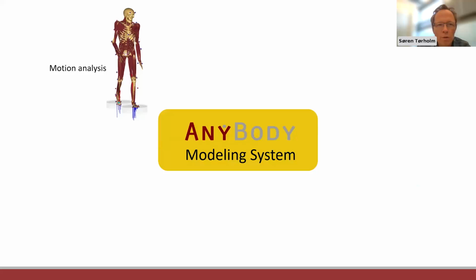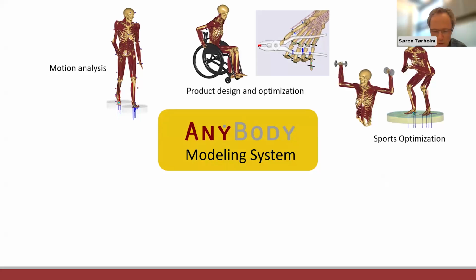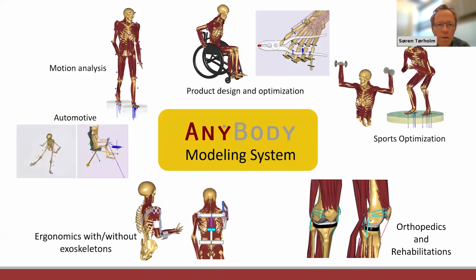These tools are being used in all sorts of scenarios. For example, of course, for motion analysis, like what you will see today, but also in product design and optimization, sports optimization, orthopedics and rehabilitation, ergonomics with and without exoskeletons, automotive applications, and many other things. But what these have in common is that it's something the person does in a voluntary and skilled manner.